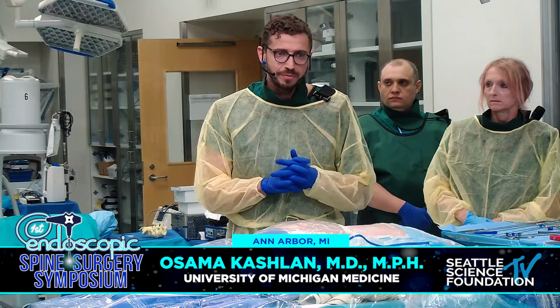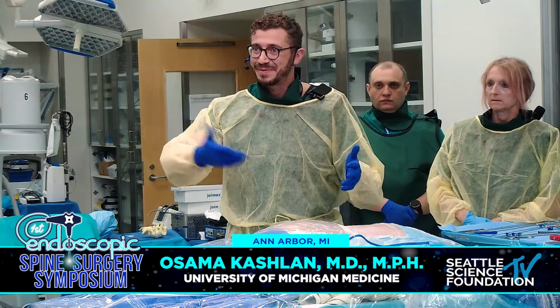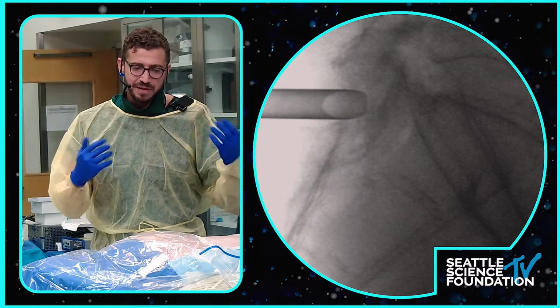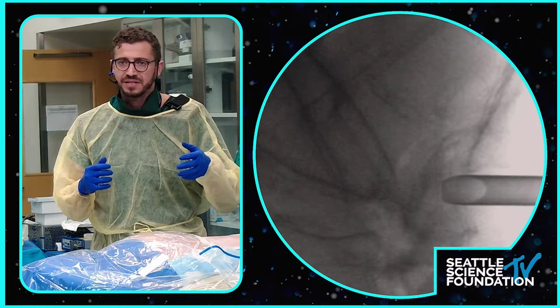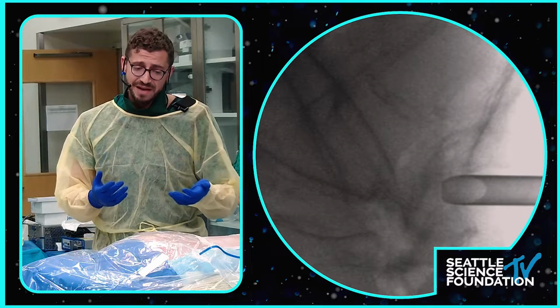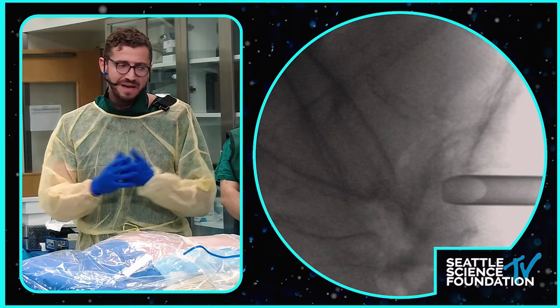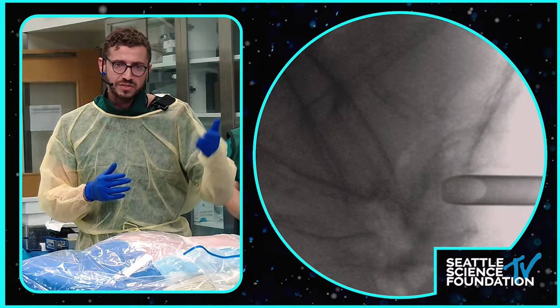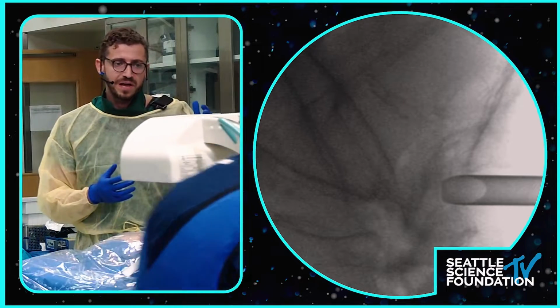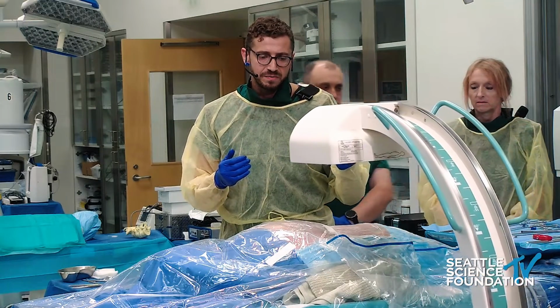In terms of the transforaminal approach, the first thing we want to do is get a perfect AP and a perfect lateral. If you'd be able to show us the X-ray here. It's very important to get a perfect AP and a perfect lateral, because you're using that to guide your instrument through the foramen. A lot of people use navigation, either conventional navigation with O-arm or any type of navigation, or there are commercially developed systems used only for endoscopy. But either way, using conventional radiographs or navigation, it's really the same way of doing it.